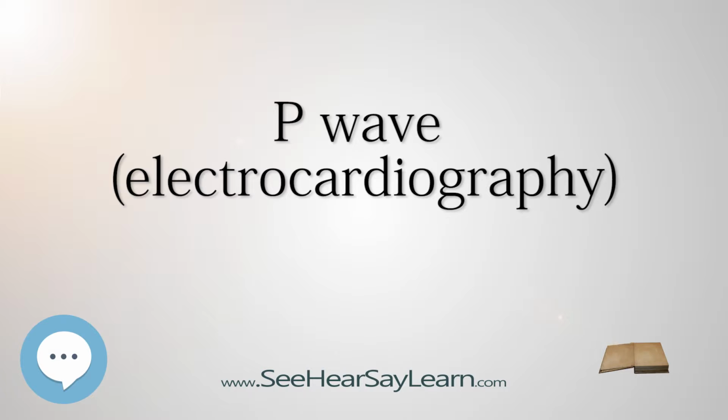A P wave with decreased amplitude can indicate hyperkalemia. Bifid P waves, known as P mitral, indicate left atrial abnormality, e.g. dilatation or hypertrophy. If at least 3 different shaped P waves can be seen in a given ECG lead tracing, this implies that even if one of them arises from the SA node, at least 2 others are arising elsewhere.